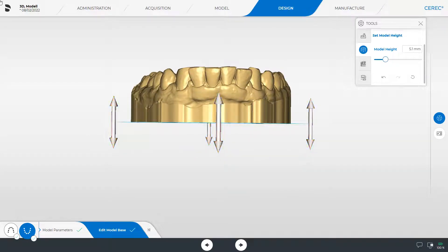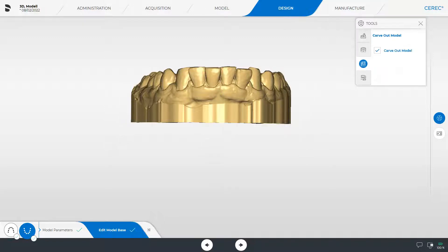We proceed with the carve out model tool. When placing a check mark next to carve out model, the model will be hollowed out.